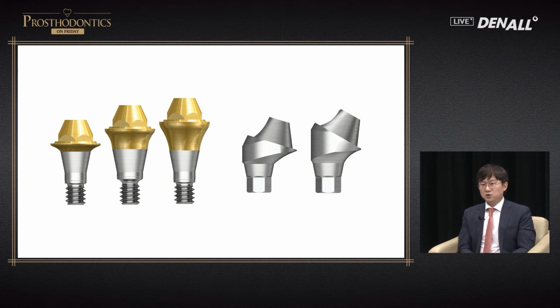When I choose an abutment, as I said before, I don't like the one with the short distance between the abutment connection to the margin of the prosthesis. So when I choose multi-abutments, I try to choose at least it should be 3 millimeters.